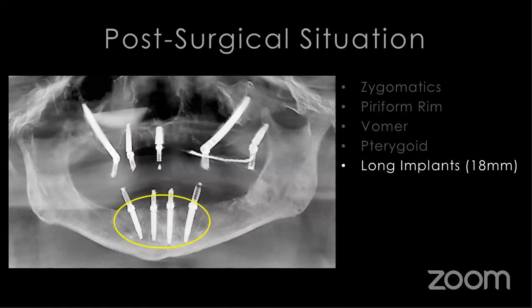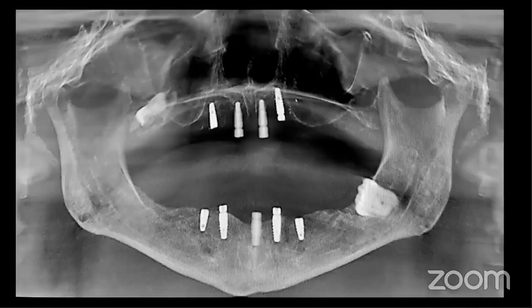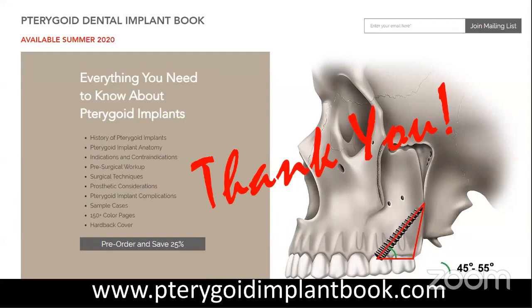In the mandible, we ended up placing a couple of long implants that were engaging the inferior cortical bone of the mandible. We had to do this because one of the reasons there were so many implant failures in this case was that his bone was just very, very soft. It was type 4 bone just everywhere. You can see that I was able to place a pterygoid implant on one side, and I was not able to place a pterygoid implant on the other side, because where he had one of the impacted third molars, there just was not very much bone available in that area. But we were able to take this, change it to this, and take the patient from having no teeth for the last almost 2 years to having teeth that he could smile with and chew with and be happy with. And the pterygoid implants were able to contribute to that.